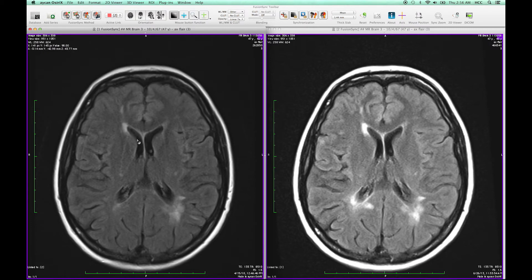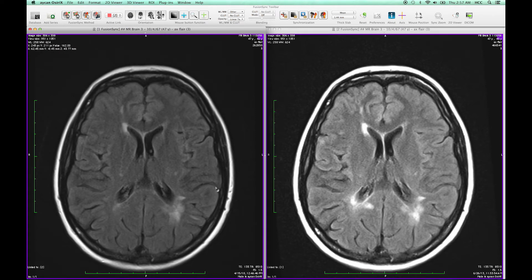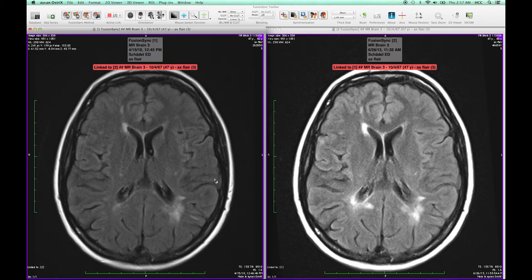In addition, the views are arranged according to time points and modalities and are placed in chronological order from left to right on the screen. The datasets themselves can be identified by the window titles, the legends in the viewers, and by the image information that is shown when pressing the CTRL key on the keyboard.